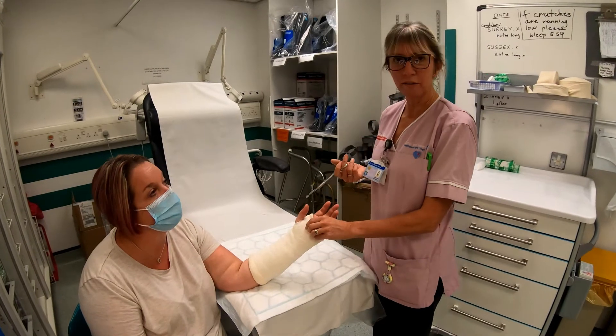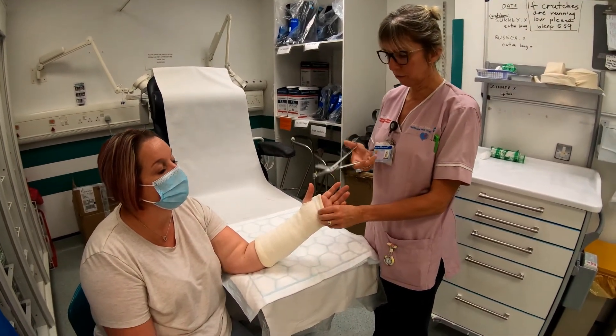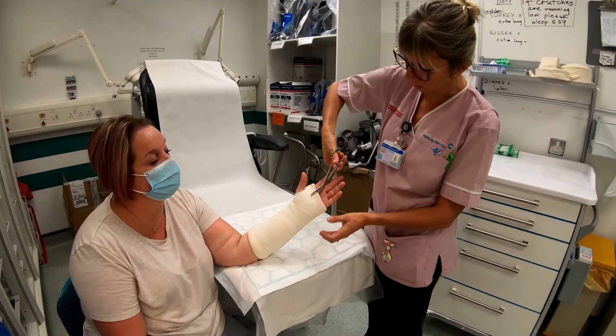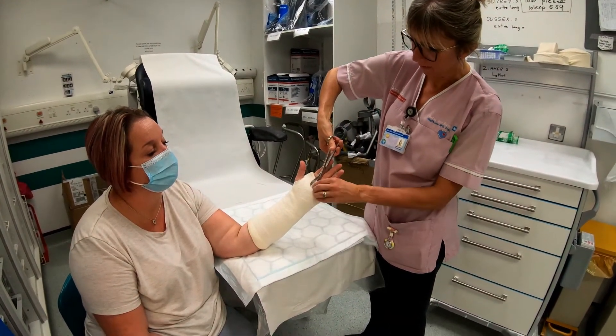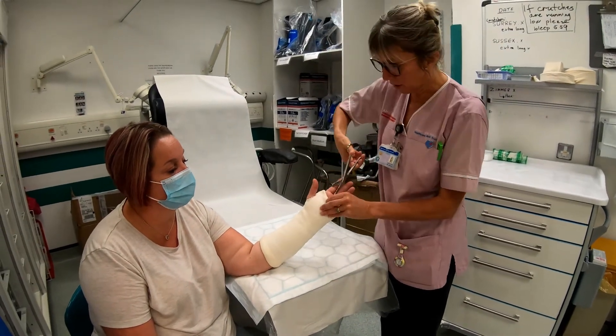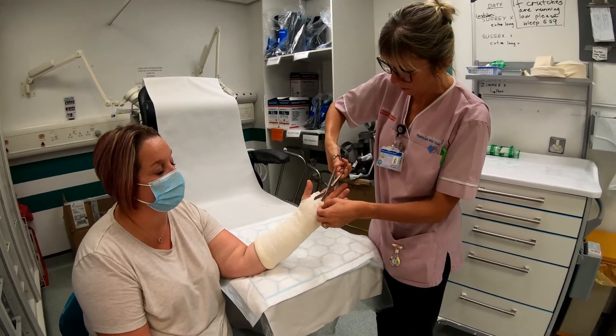If you ever have to remove a plaster cast, make sure you take it layer by layer and don't put your scissors through the whole thickness of the plaster. Obviously you need to do it on the soft side, but don't go through the whole thickness — it could be quite worrying for the patient.